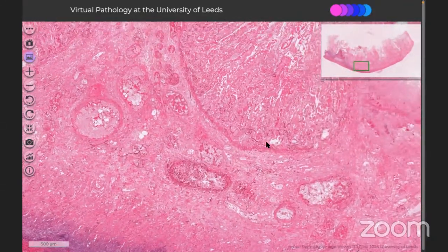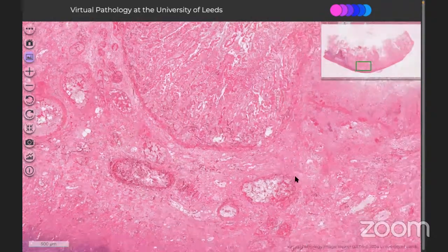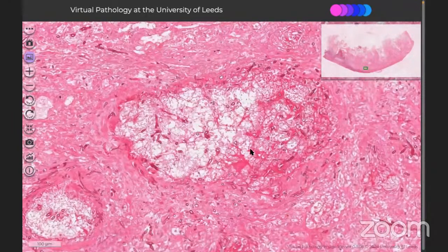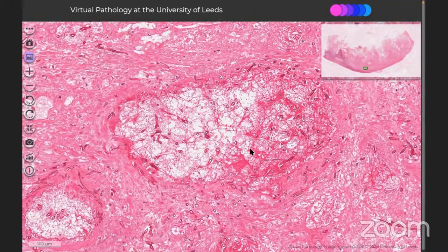Because it is showing angioinvasion, it is systemic by now. Once you detect angioinvasion and mucor, it becomes clinically important. You need to notify the clinician about the fungal organism as quickly as possible, because they are going to start treatment for this case. Number one, that is the first thing you should do.